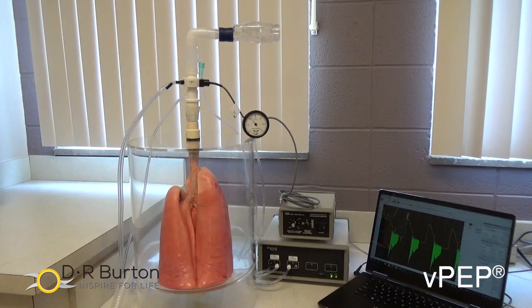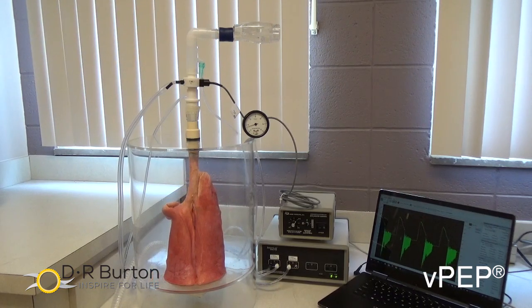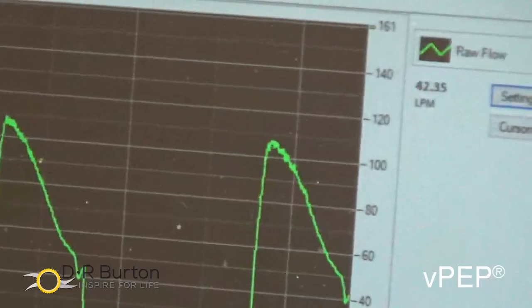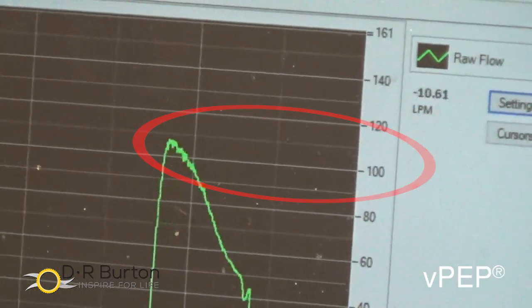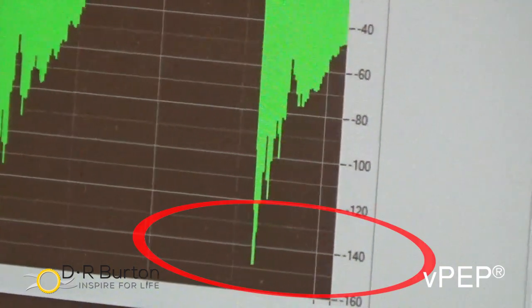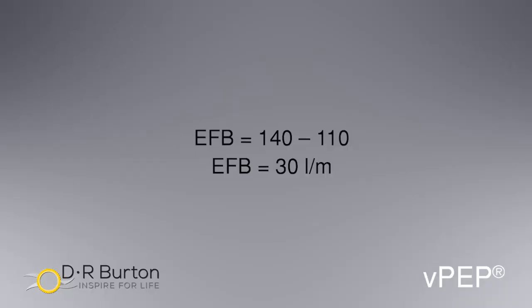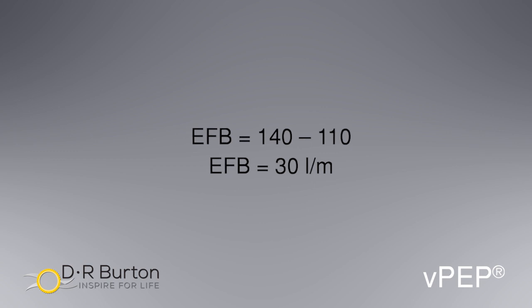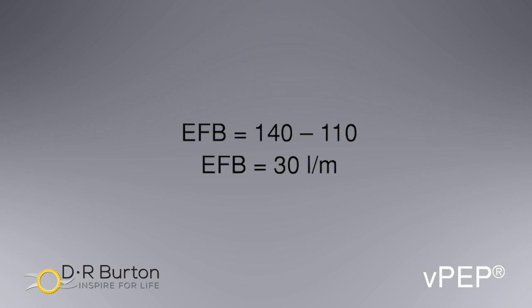Returning to the VPEP setup with the lung box, we can examine the flow loops on the screen. Notice that the peak inspiratory flow is about 110 liters per minute, and the peak expiratory flow is about 140 liters per minute. This demonstrates an expiratory flow bias of 30 liters per minute, which would move airway secretions toward the oropharynx to be coughed out by the patient.